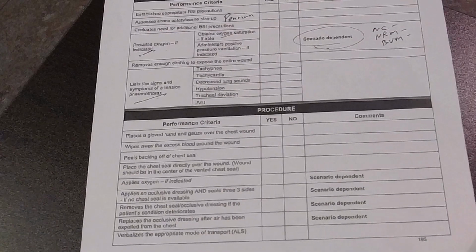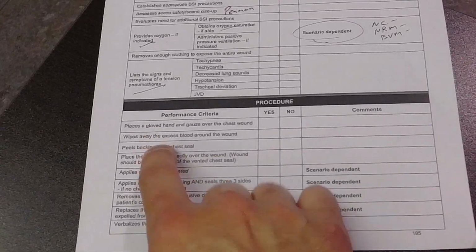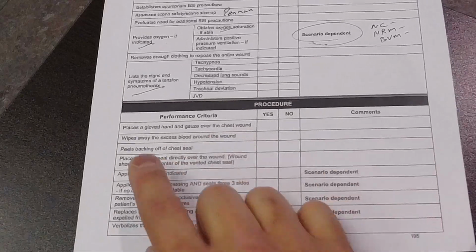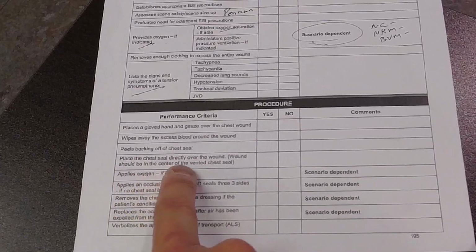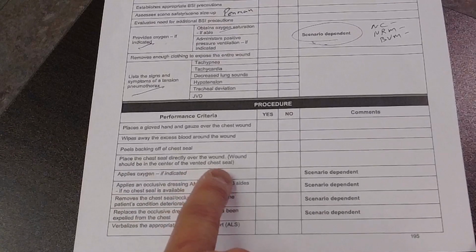And when you take a look at your skill sheet again, to deal with a penetrating chest injury, the first thing you want to do is place your gloved hand and gauze over the chest wound. Wipe away the excess blood around the wound. Peel off the chest seal. Place the chest seal over the wound. The wound should be in the center of the vented chest seal.